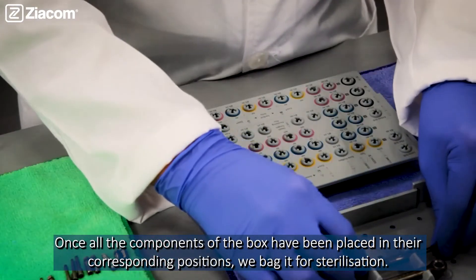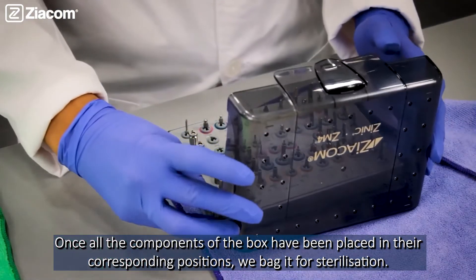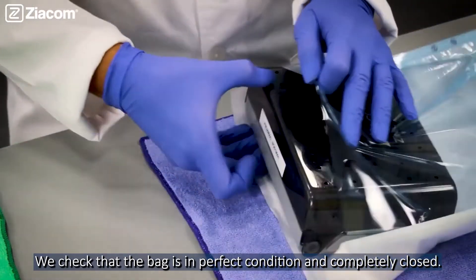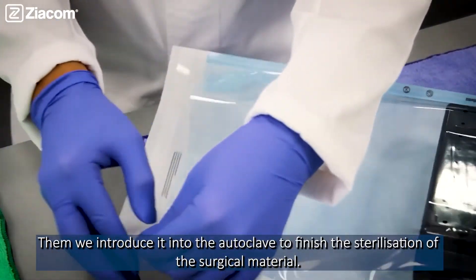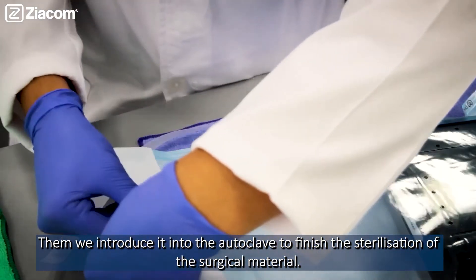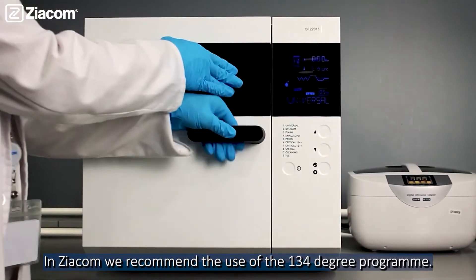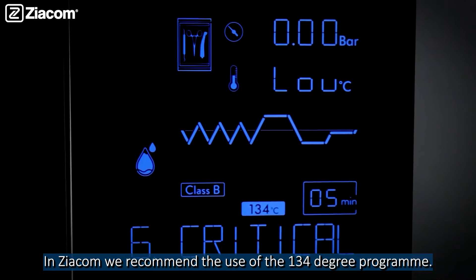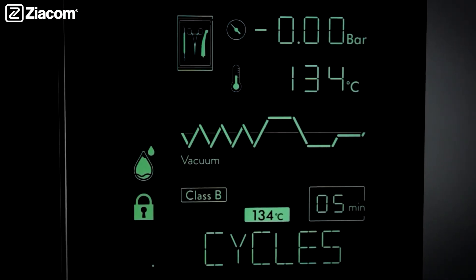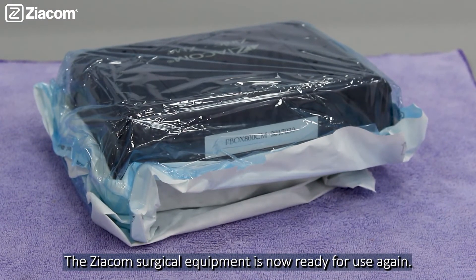Once all the components of the box have been placed in their corresponding positions, we pack it for sterilization. We check that the box is in perfect condition and completely closed. Then we introduce it into the autoclave to finish the sterilization of the surgical material. In Ziacom we recommend the use of the 134-degree program. The Ziacom surgical equipment is now ready for use again.